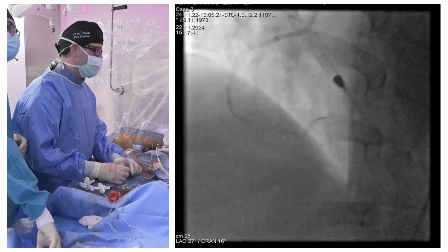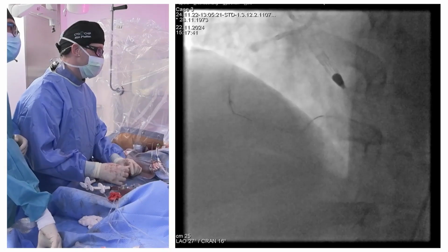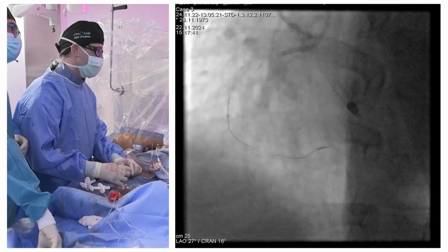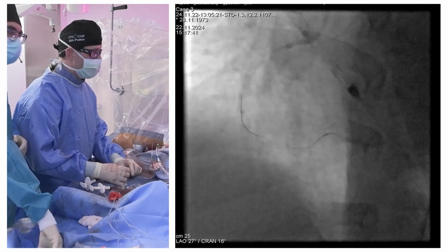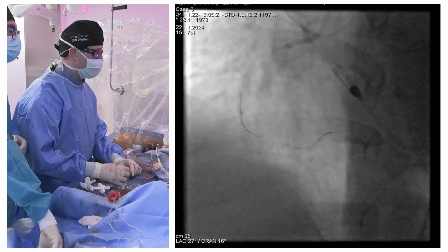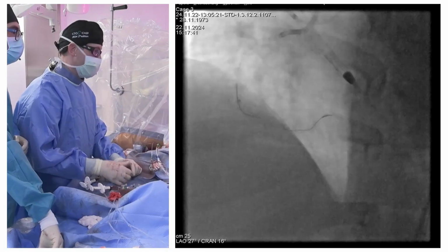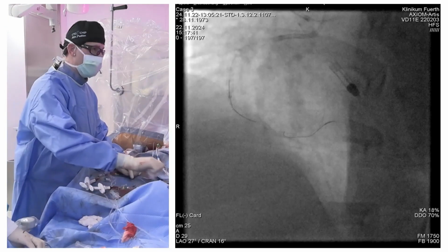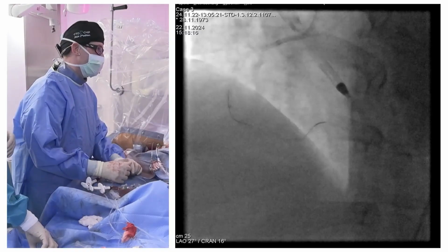And that's actually the spot where we left the system antegradely. So that must be a relatively tough part. We might switch back to a Miracle again. All the other wires have been too soft so far. We might even try again a Gaia retrogradely, just because you can steer it a little better.